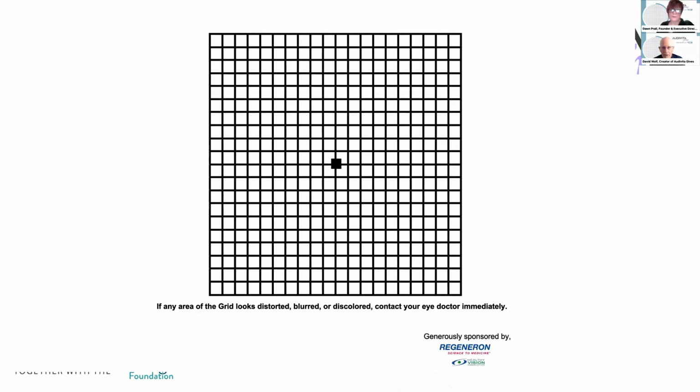Okay. So in other words, the way it presents to you visually may change over time, which is absolutely the indicator that you have the disease, am I right? Right, or that it's progressing. And that's how you monitor it.